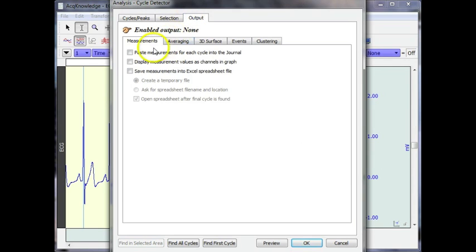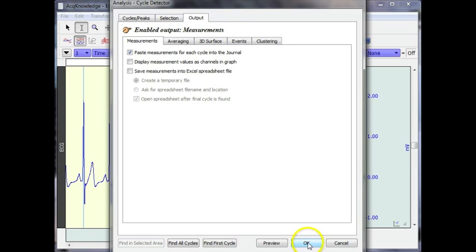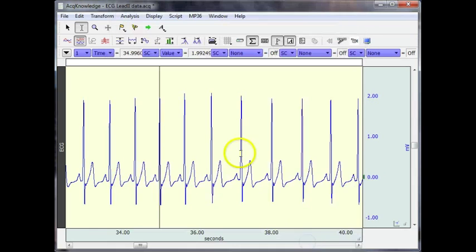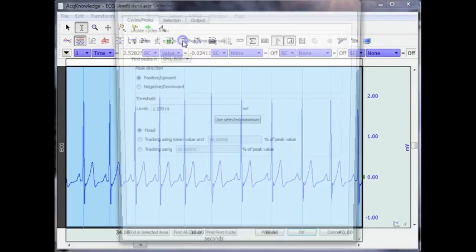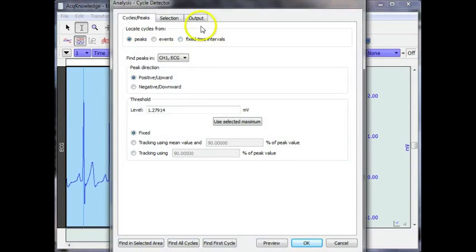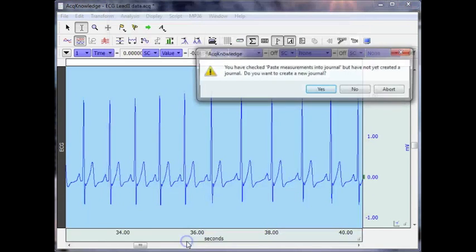Now if we go back into the dialog, there is an option over here that will allow me to paste those measurements down into a journal file. And I'm going to say OK. I'm going to come in and select all of the data, come back in and say find all cycles.